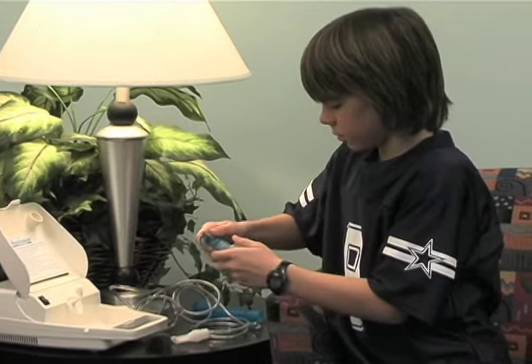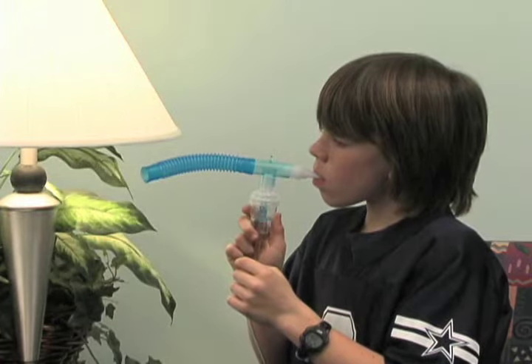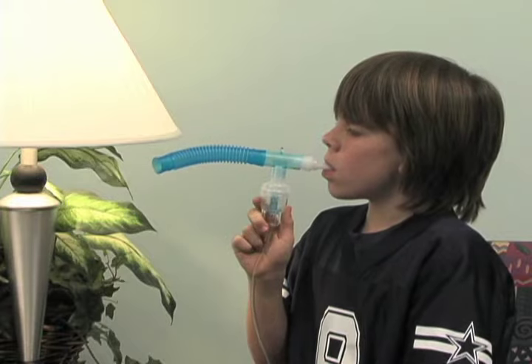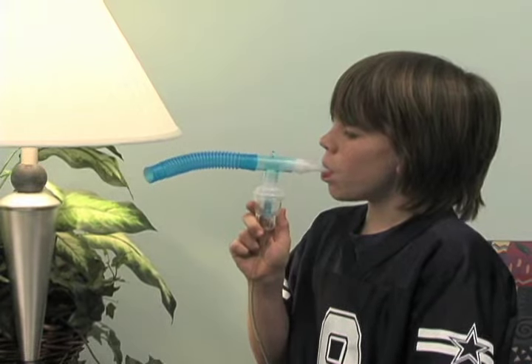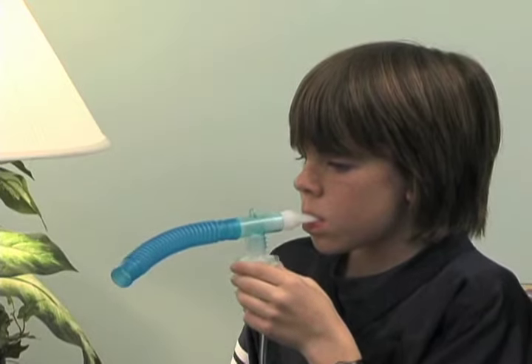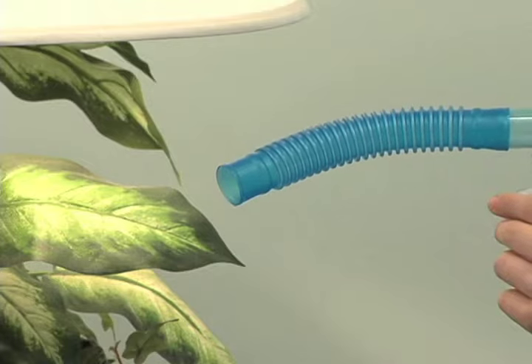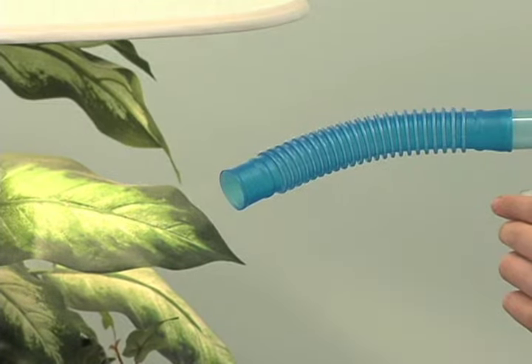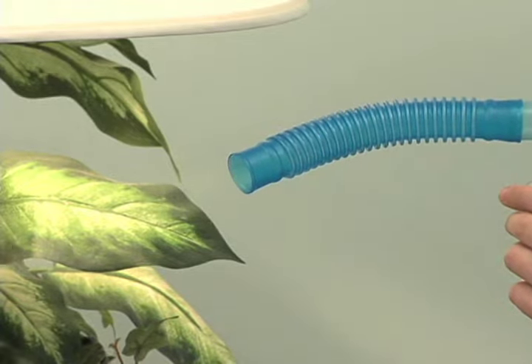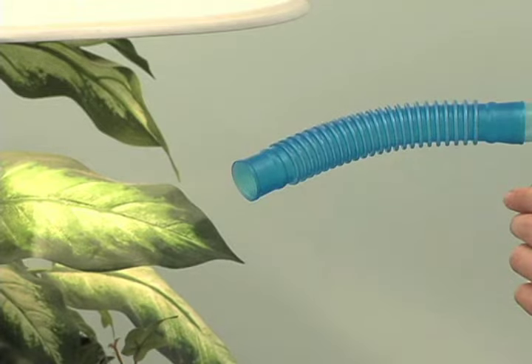For children 8 years or older, use the mouthpiece for the treatment. Have your child place the mouthpiece between their teeth. Have them close their lips tight around it, making a seal. Have your child take slow breaths through their mouth, not their nose. You should see the mist disappear from the flex tubing when they breathe in. This lets you know they are doing the treatment right. You may have to coach your child when they first are learning how to use the mouthpiece, and be sure to give them lots of praise when they do it right.